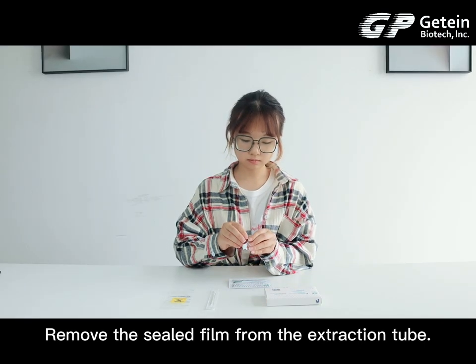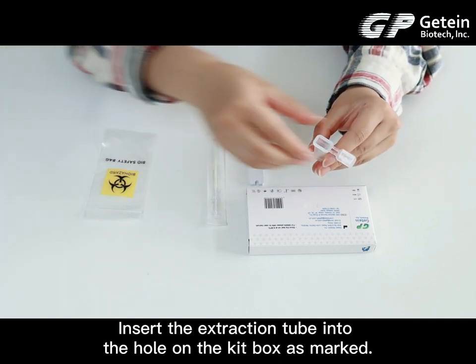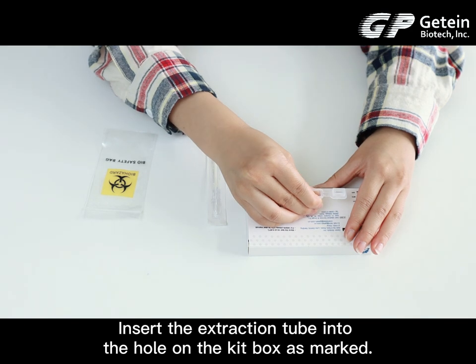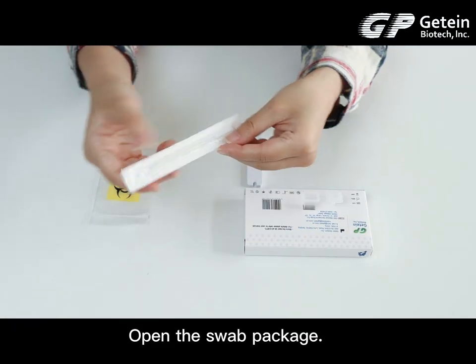Remove the sealed cap from the extraction tube. Insert the extraction tube into the hole on the kit box as marked. Open the swab package.